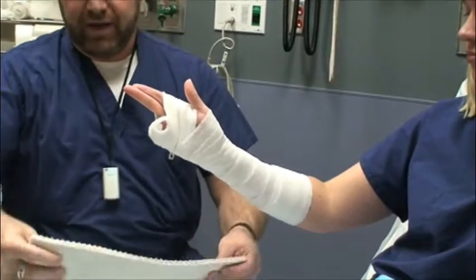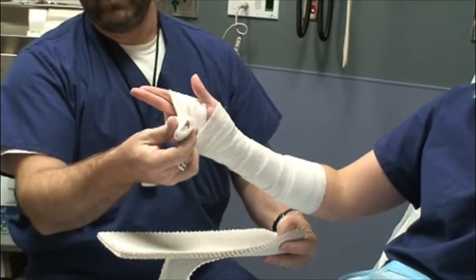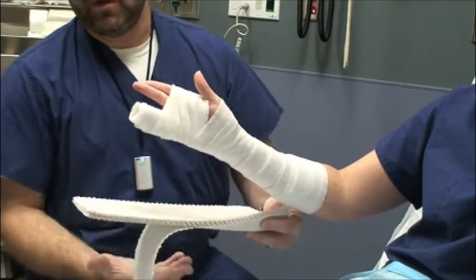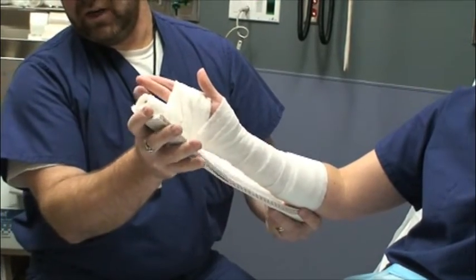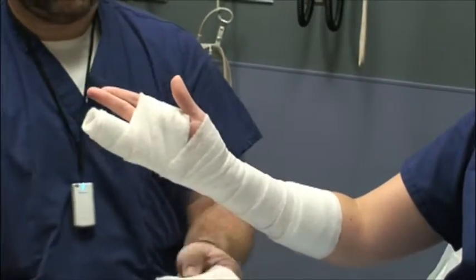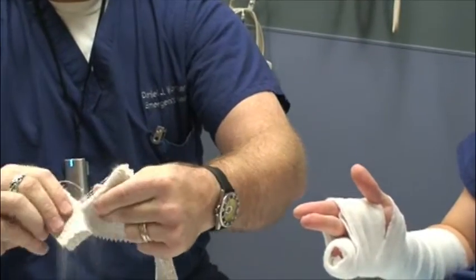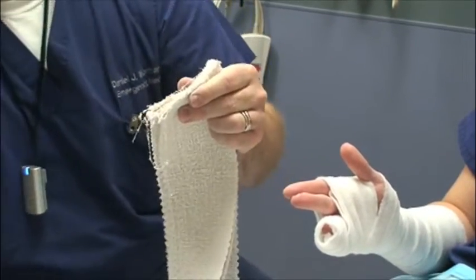For upper extremity we're going to have 10 layers of wrap. You can put this mold — it's easier to just do it straight — going out from the tips of the fingers and measuring back. This material is usually pretty easy to tear, but if you have problems you can go ahead and use a pair of scissors.